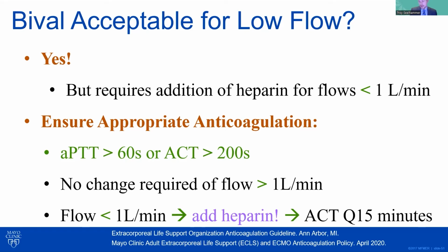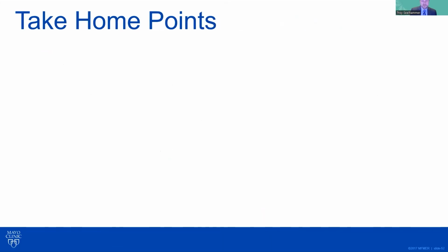And so once we get to that threshold, add the heparin, and then we draw ACTs every 15 minutes. And this is really to titrate the heparin effects, not the bivalirudin effect specifically.